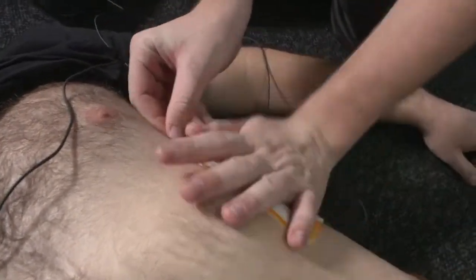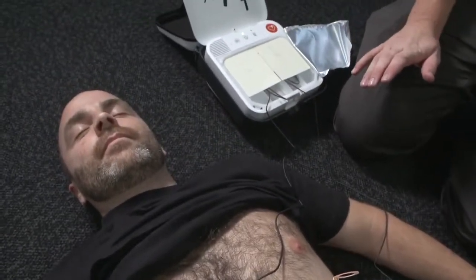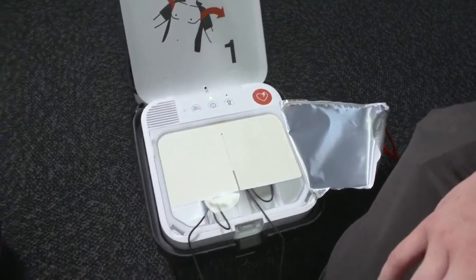Pull red handle to reveal pads. Do not touch patient. Analyzing heart rhythm. No shock advised.